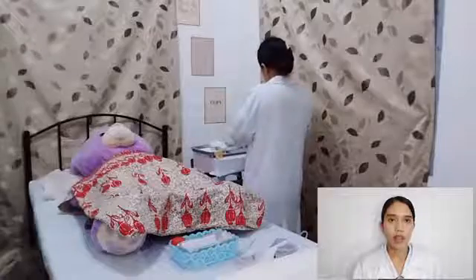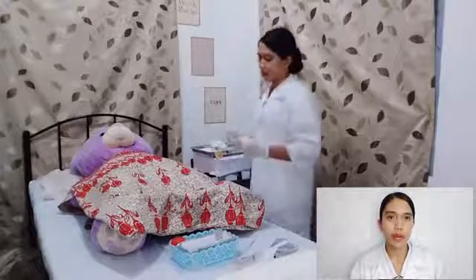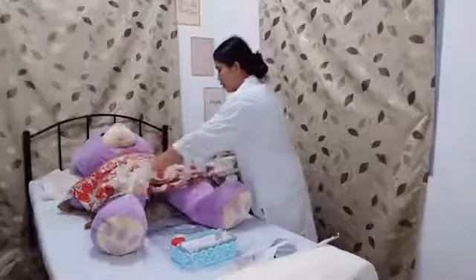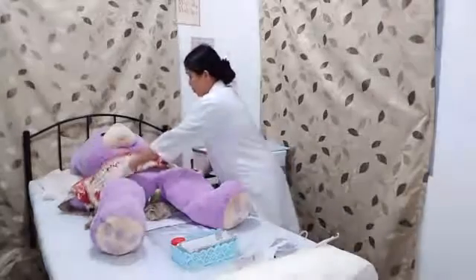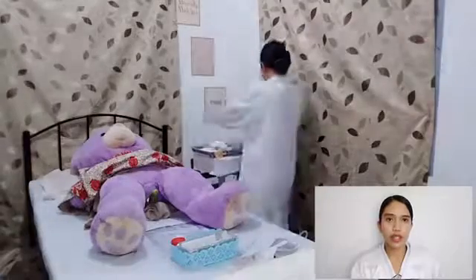Wash hands and put on working gloves. Hand washing prevents the spread of microorganisms. Put on sterile gloves. This is to avoid cross-contamination of microorganisms. Do perineal care or flushing and discard working gloves after cleaning the perineal area. Okay, Mr. Gray, I will pull up the cover and I am going to do the perineal flushing first. Cleansing the perineal area prevents the introduction of bacteria.